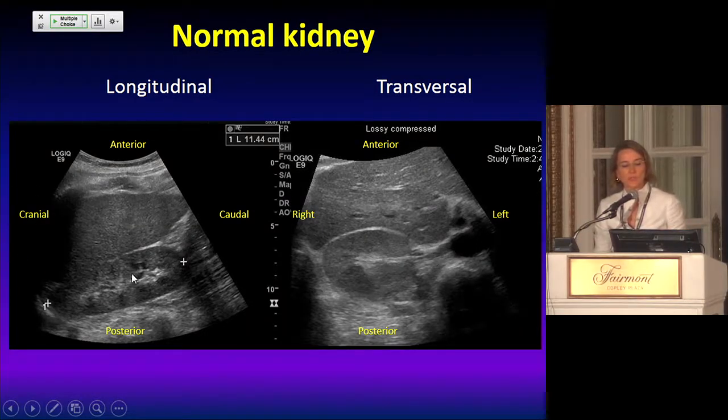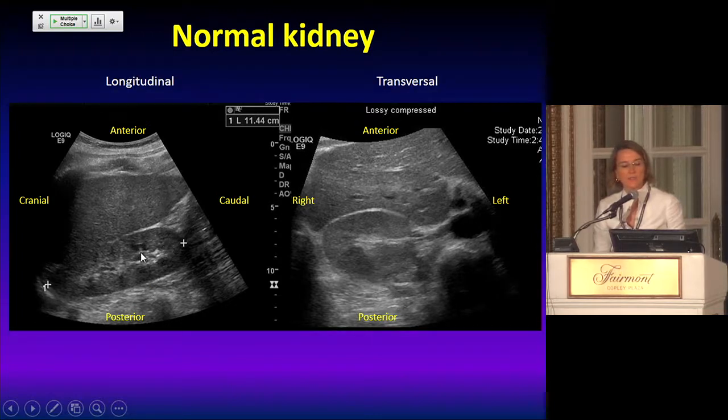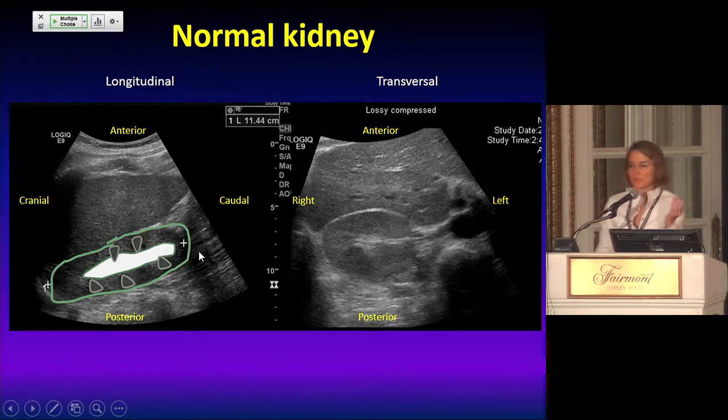So here you see the liver, the kidney, the size of the kidney. You see the increased echogenicity, which is the sinus fat. You may see these darker structures right there. Okay. And what are those structures? Now that you looked at the anatomy, they are in a typical location for the pyramids. So the pyramids are usually a little bit less echogenic than the rest of the kidney. So that maybe made you mistake them for cysts or hydronephrosis.